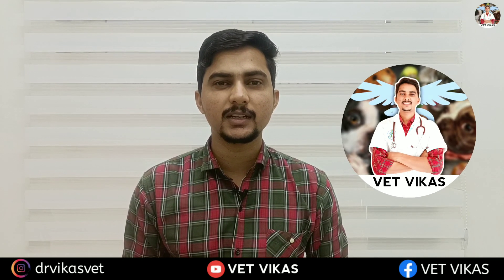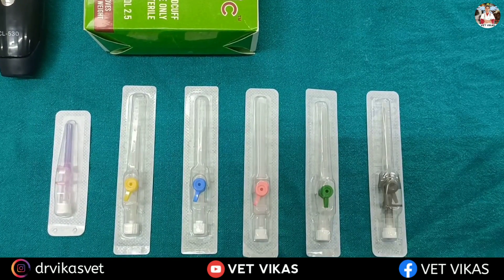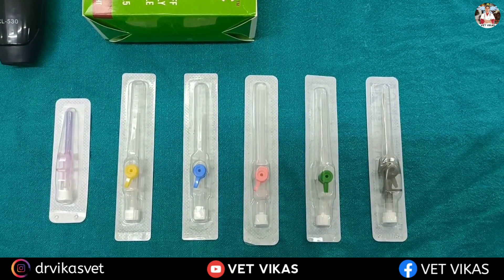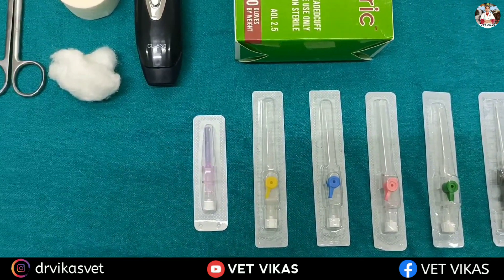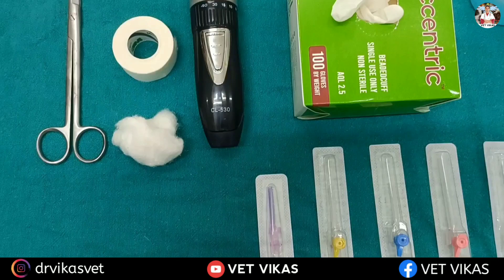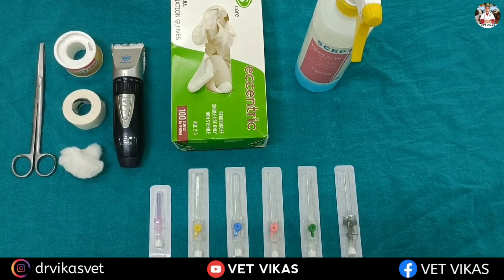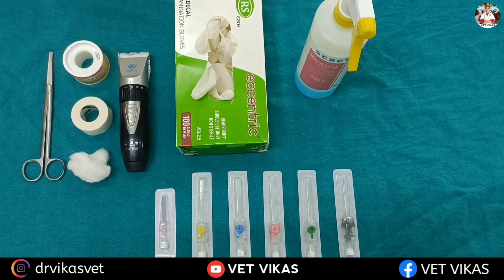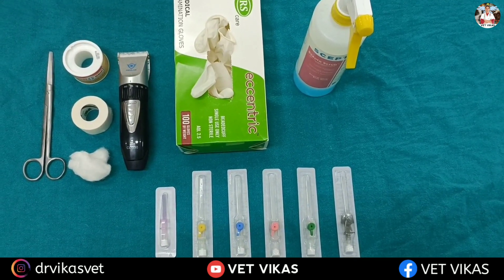Hello guys, welcome back to the channel. In today's video we are going to learn about IV cannula placement in dogs. For this procedure you need the following things: a trimmer to clip the hairs at and around the site of IV cannula, a cannula of appropriate size, tape for securing the IV cannula, scissors, spirit swab, dry cotton, and gloves. If you are comfortable with gloves, you can use gloves also.